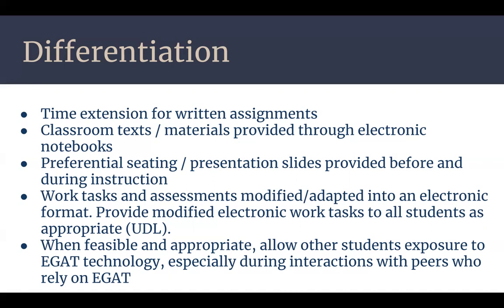And when it's feasible and appropriate, allow other students exposure to the EGAT technology. Now, it's important to keep in mind to maintain the dignity, the privacy, and the space of an individual who is utilizing the device, but allow for those interactions with peers. Perhaps there's more chance for an EGAT user to really speak and request and comment with their peers. And so incorporate that into instruction and into interactions. The more interactions, the more normalized and the more frictionless activities will become.